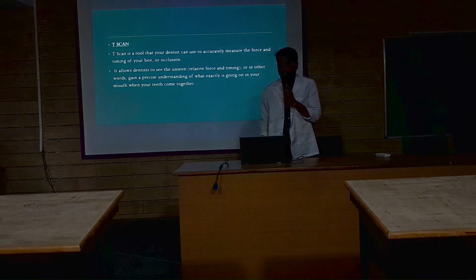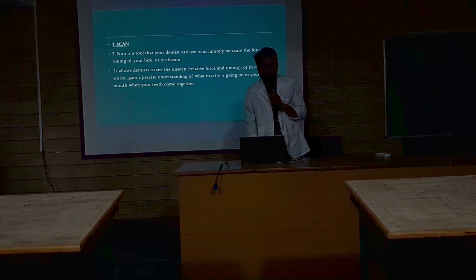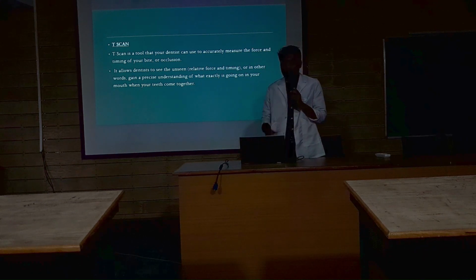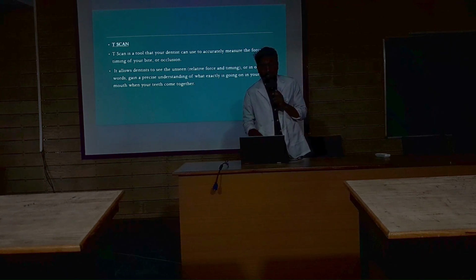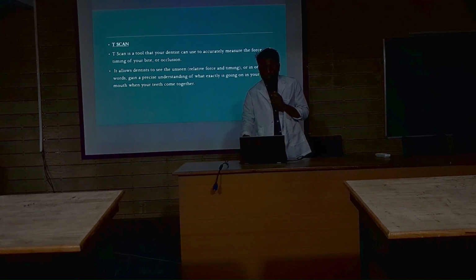Next we have Tscan. Tscan is a tool that a dentist can use to accurately measure the force and timing of your bite or occlusion. To know the bite or occlusion of the patient, we can use this machine known as Tscan. It allows dentists to see the unseen, the relative force and timing, or in other words, gain a precise understanding of what exactly is going on in your mouth when your teeth come together.